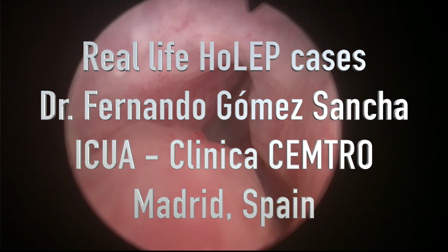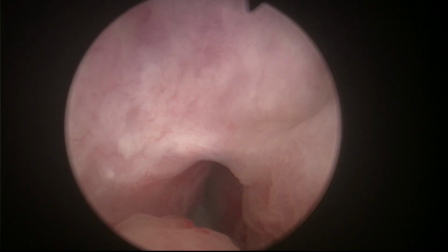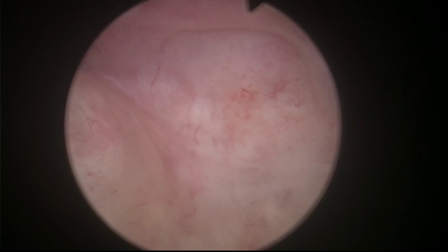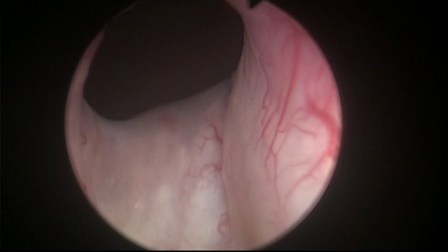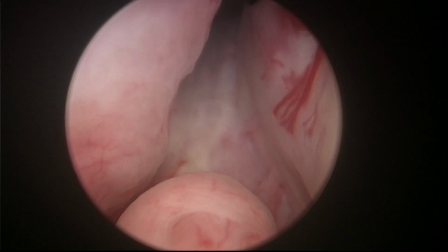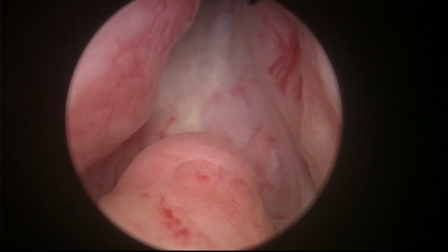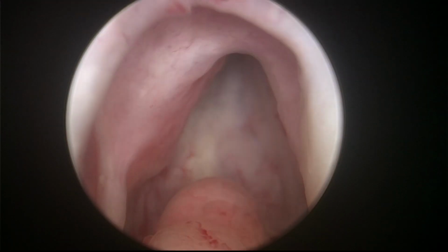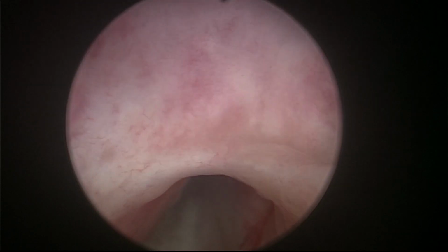Hello, this is Fernando Gomez Sancha, and I'm going to present a case of a patient who underwent REZUM treatment without success, and he was complaining of recurrent infections. And as you can see, there was a cavity apically near the sphincter, and probably that was the reason for his recurrent infections.